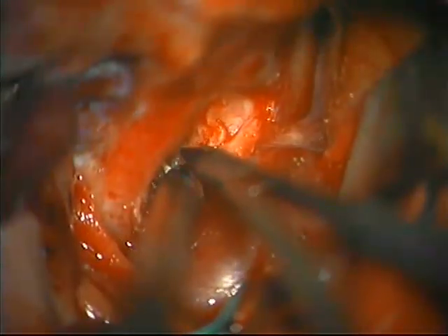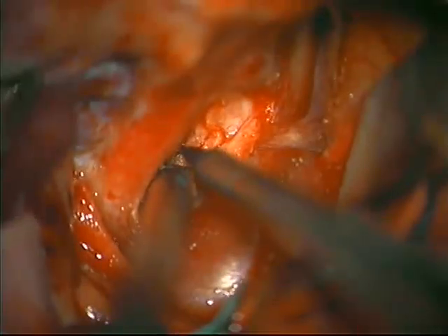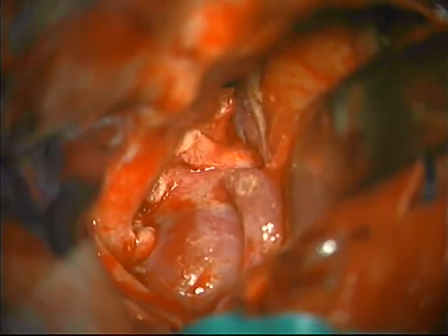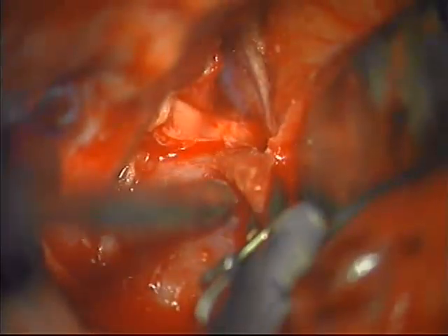Now we open the distal dural ring as well as the covering of the optic nerve. Now the aneurysm is ready to be clipped.